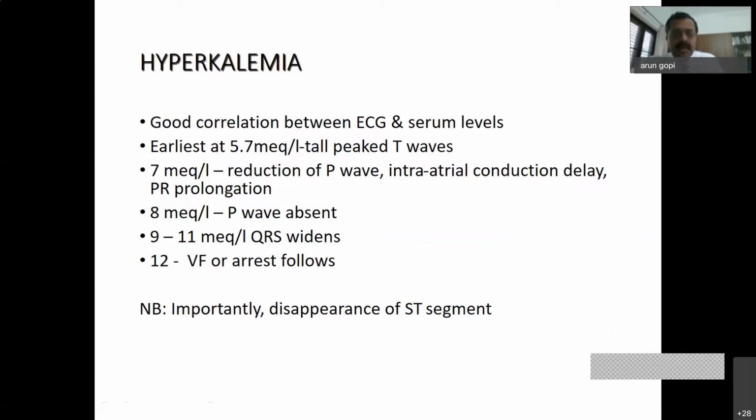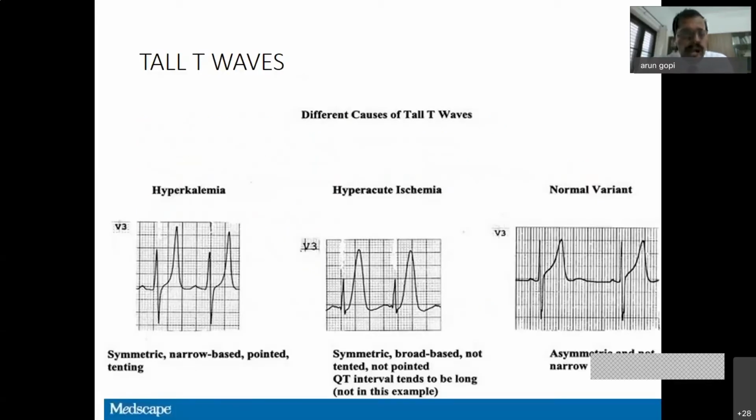So I think ECG in various disorders, I can keep on going, but in the interest of time, I'll stop here, saying that ECG is a wonderful and very cheap diagnostic tool, which gives us a tremendous amount of information for diagnosis of not only various cardiac disorders, but also various extracardiac pathologies, provided you have a systematic analysis of this paper. I'll stop here.